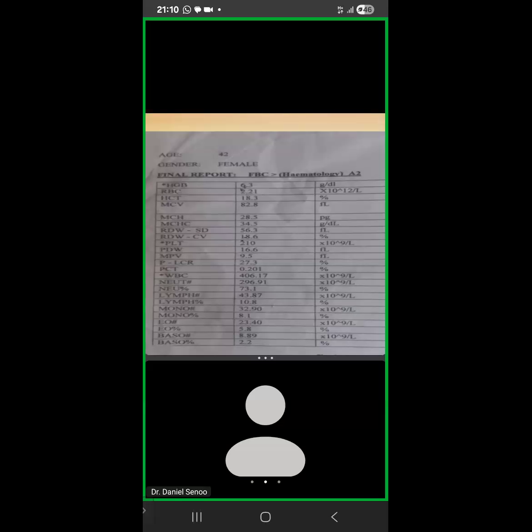So what shape of RBC would you be seeing? I'll be seeing anisocytosis, and then what? Shape of red cell, which one will you be seeing? Are you seeing sickle shape, or acanthocytes, or echinocytes, or codocytes? Which shape? You may see elliptocytes. Anybody else? MCV.